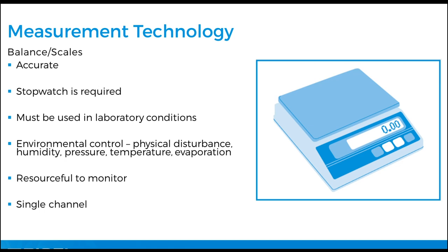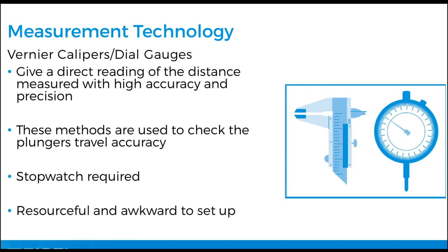So we've used the scales, and it's a cumbersome setup. It's not ideal. Especially in a healthcare organization where you want quality management systems in place, you want to be mitigating risk, you want to be managing this risk. Well, if I was to evaluate risk with these other devices, I would have to accept some of the risks involved in these different measurement technologies. There's a particular infusion device manufacturer that uses vernier calipers and dial gauges.